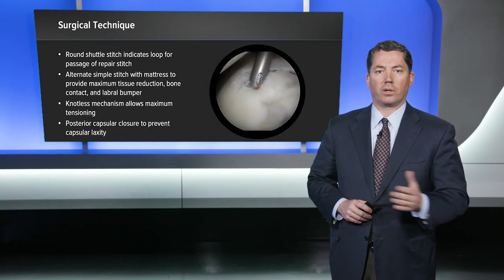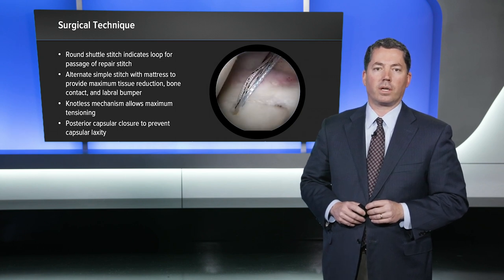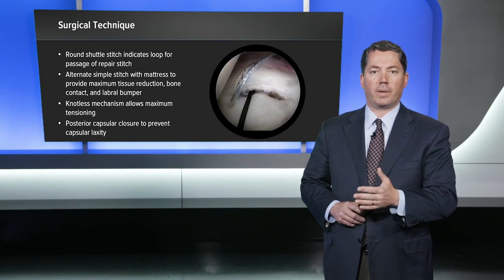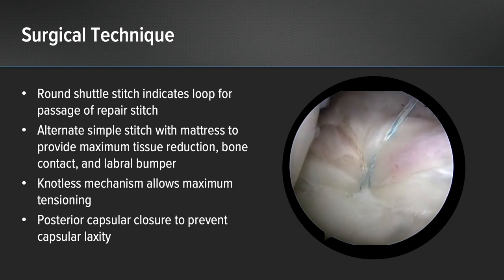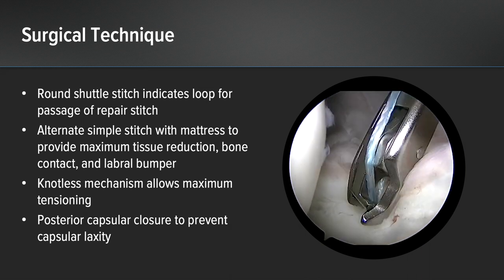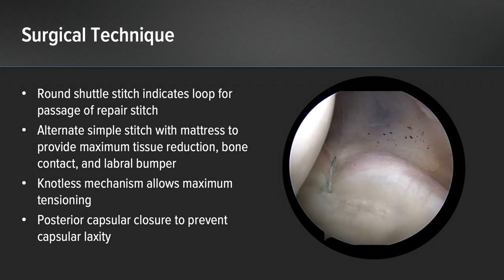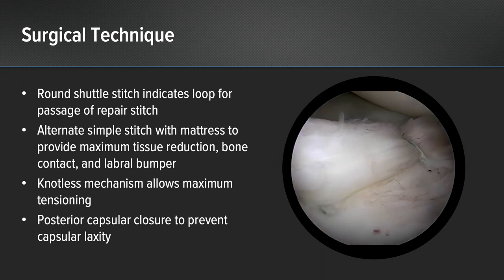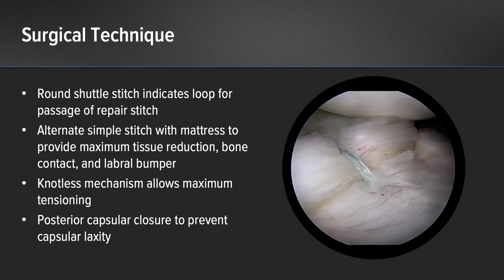As I continue up the glenoid from inferior to superior, I like to alternate sutures — a mattress suture low, followed by a simple suture, followed by a mattress suture, followed by a simple suture. This allows for maximum fixation and tissue compression along the glenoid neck with the mattress suture, and maximum labral bumper with the simple suture. If you look at these simple sutures critically as you release tension from the shoulder, oftentimes a simple suture allows the labrum to roll off the glenoid and roll down the glenoid neck. The mattress suture will prevent this.